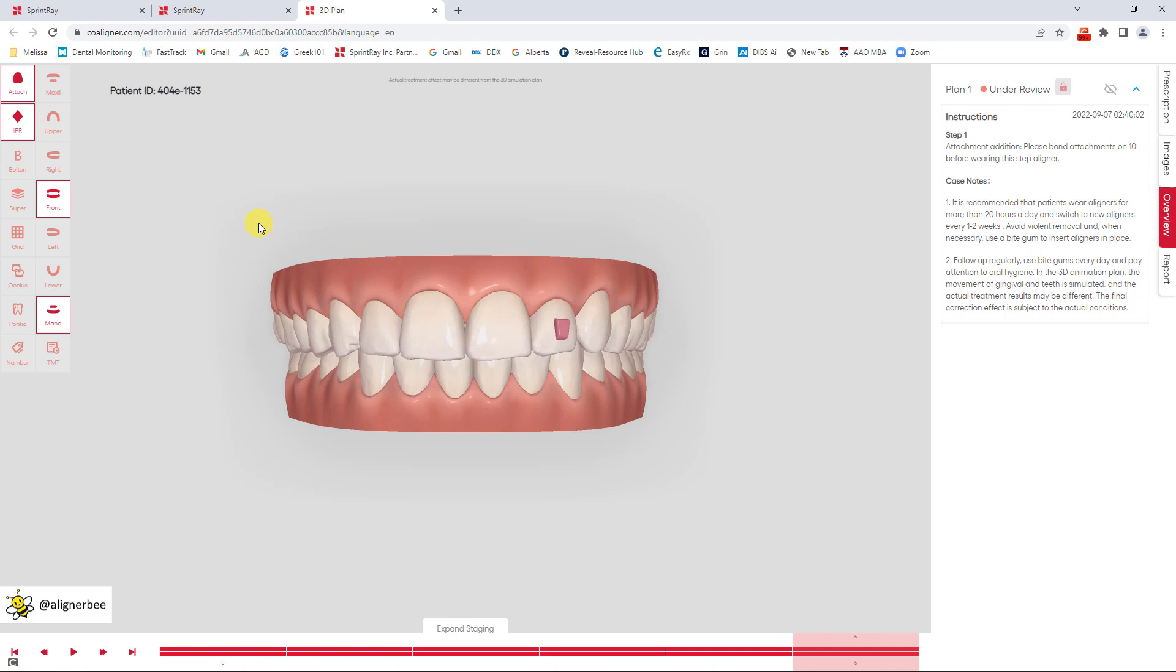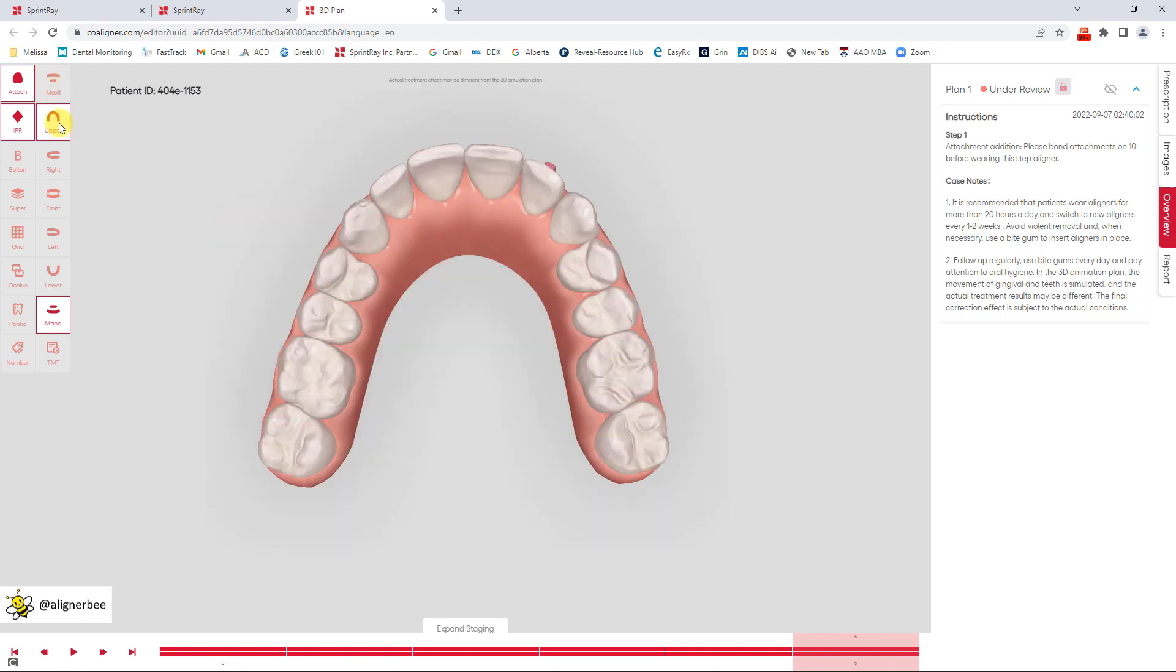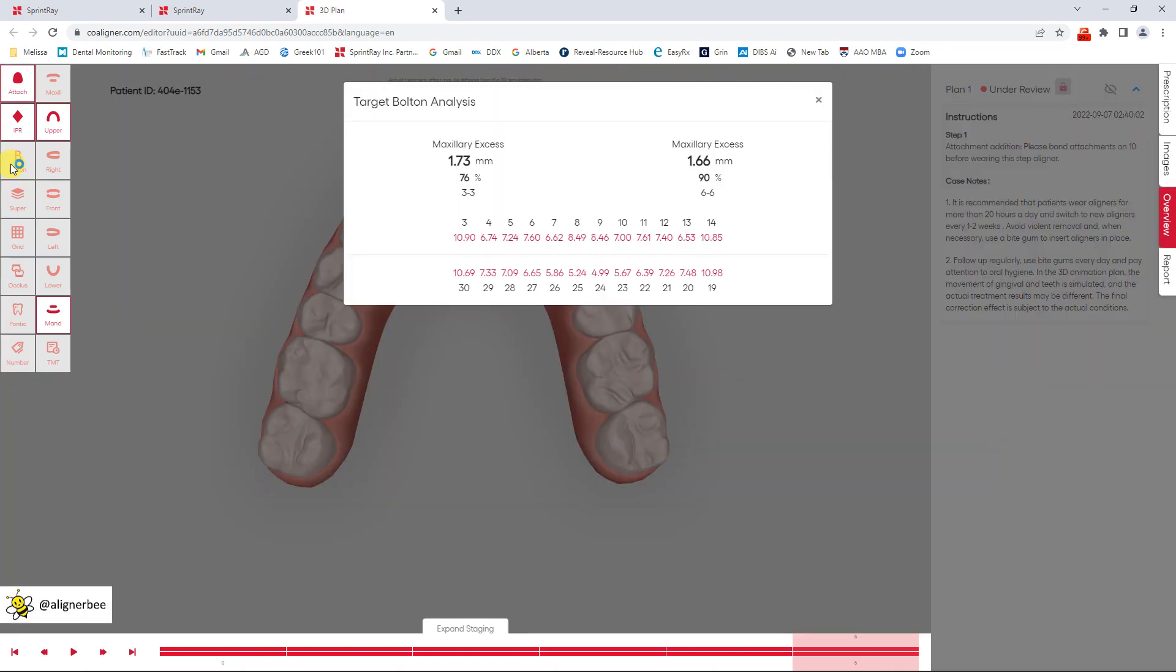Some of the features that I really liked in this software compared to most typical design services is that they had a few more robust features. So there is a Bolton analysis if you want to see the tooth size discrepancy.